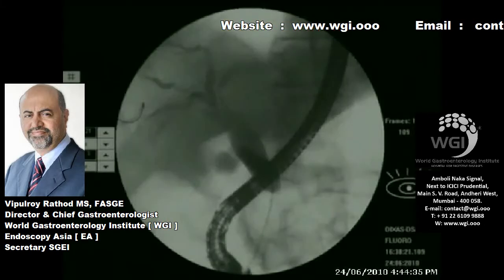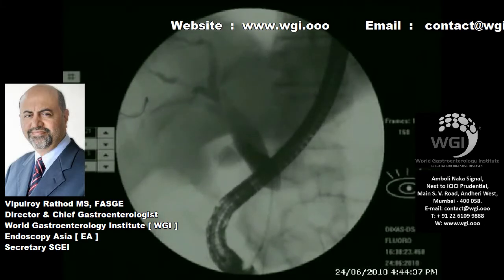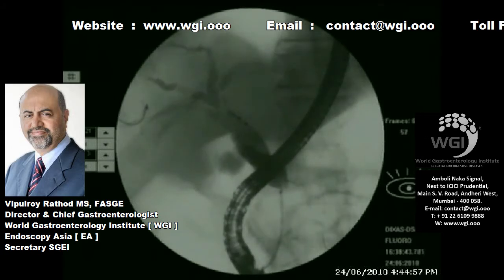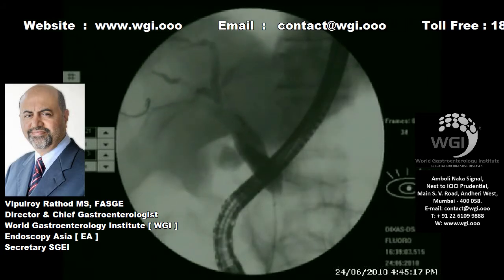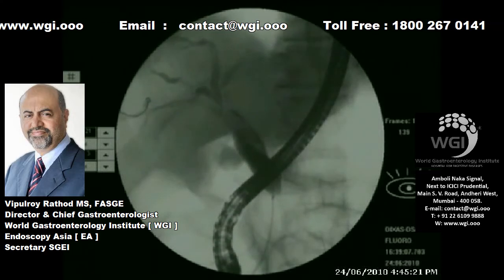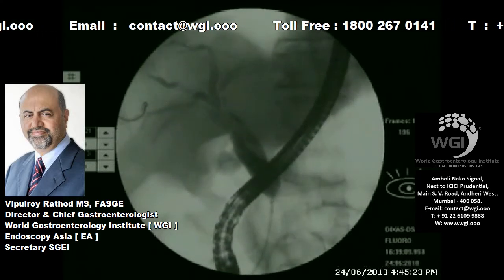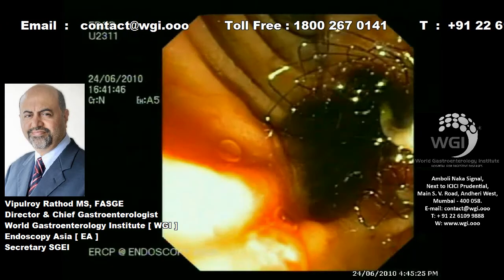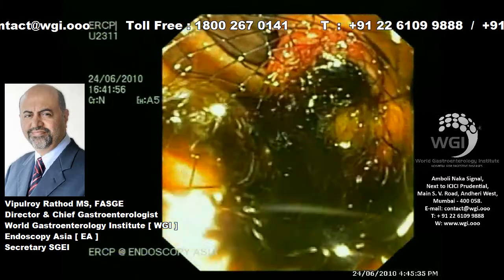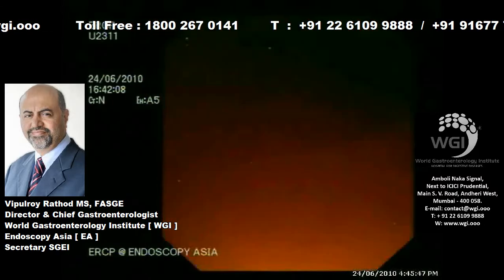8 centimeter stent. We prefer to keep a little longer stent for a definitive palliation, because we do not want the tumor to creep up and have tumor overgrowth with a 6 centimeter stent. But in those patients where we plan resection, we do prefer a 6 centimeter or 4 centimeter uncovered stent, and then subsequently send this patient for staging.